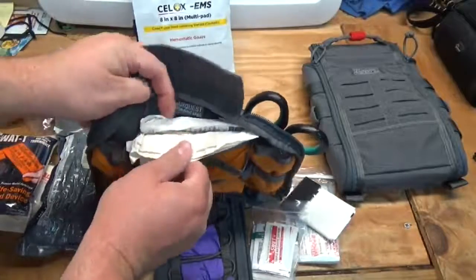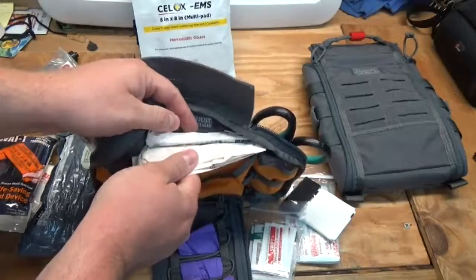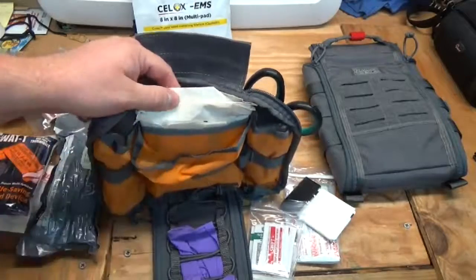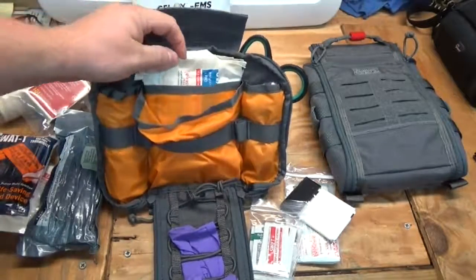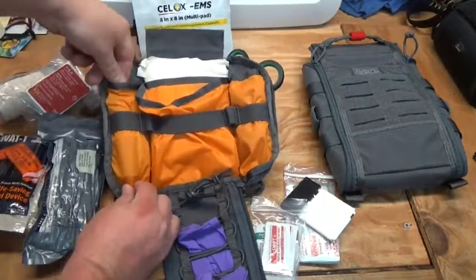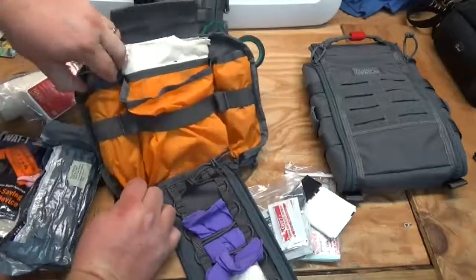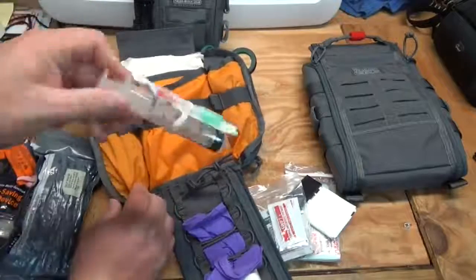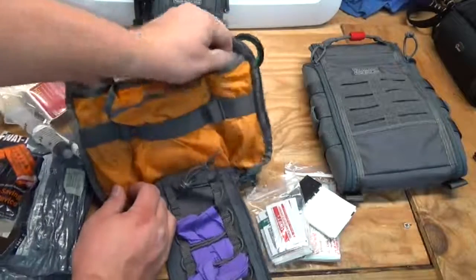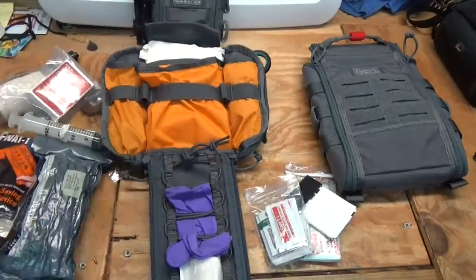In the back compartment it's loaded up with several five-by-nine gauze dressings, about five four-by-four sterile dressings, and a couple of sterile eye pads as well. On the little flap pocket I have an irrigation syringe — it's a little hard to get out because of the tourniquet on the outside. Over here I have a small bag with four more pairs of gloves.